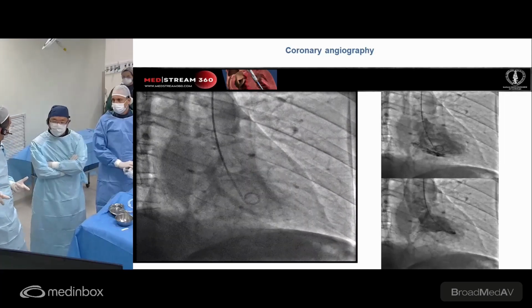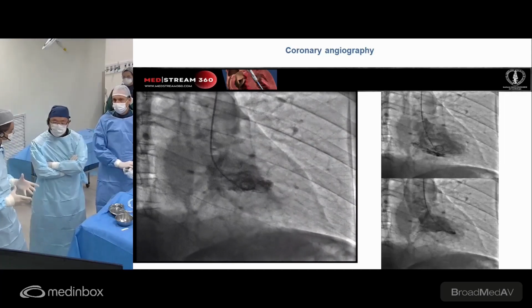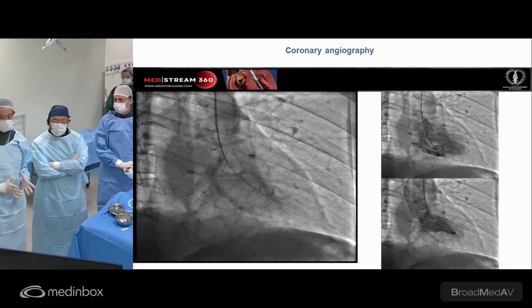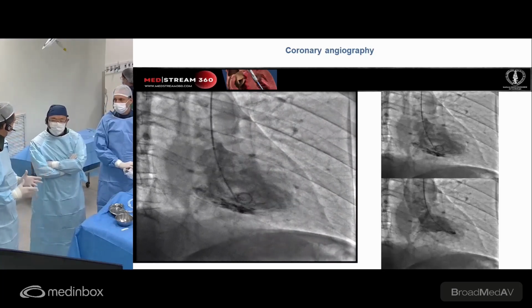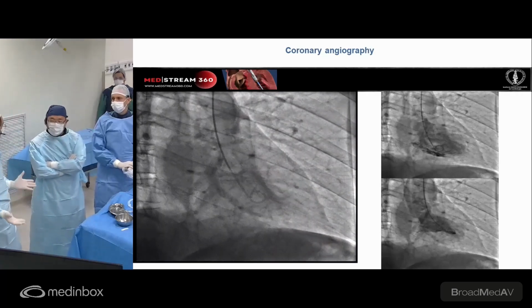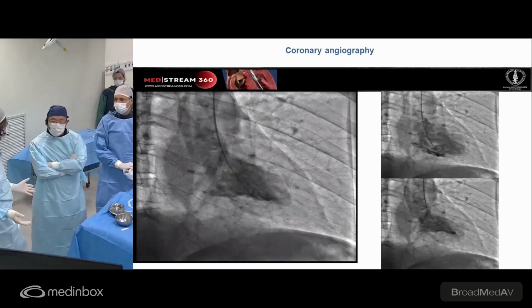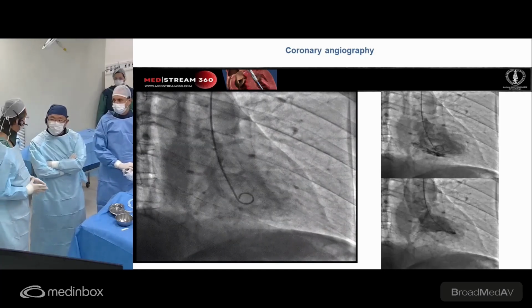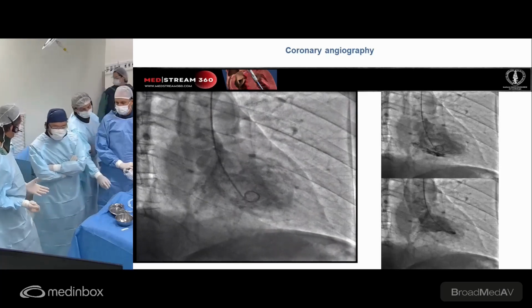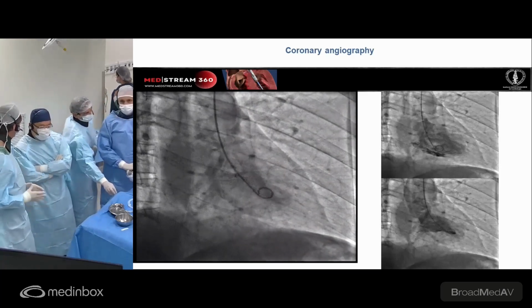We could see the distal flow of the LAD is great. The distal bed of the artery can get a very good internal mammary graft with low cardiac mortality, perhaps less than 1%. Or would you call Rodolfo to open this total occlusion with 2 months of age and do a PCI?